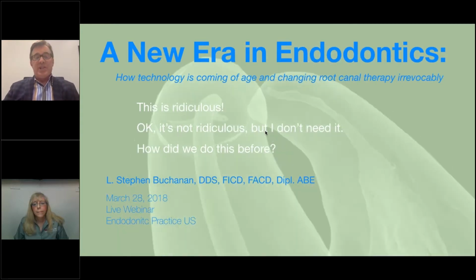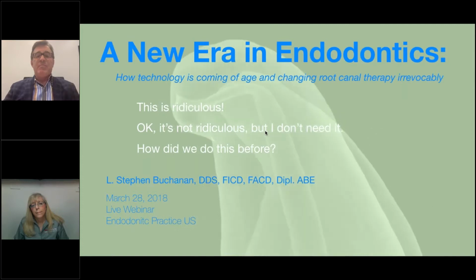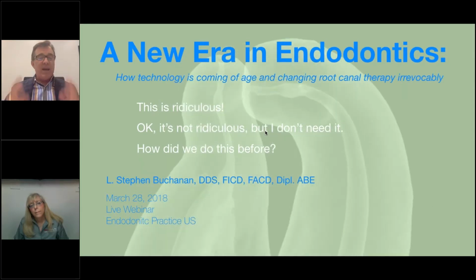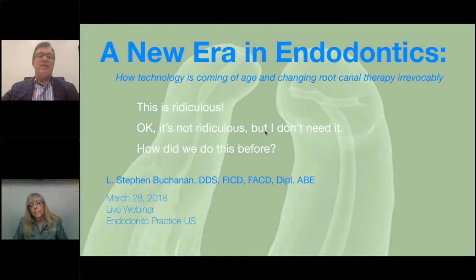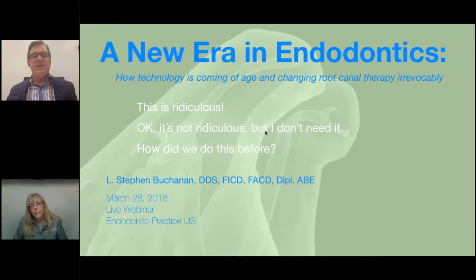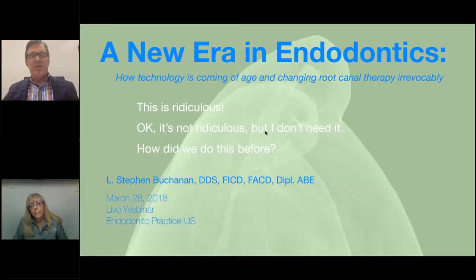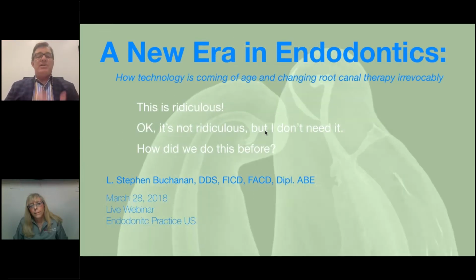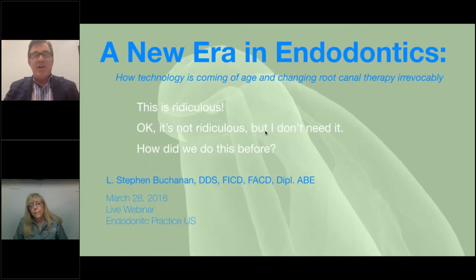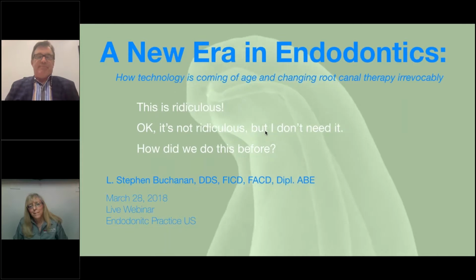Only 1% of the GPs have microscopes, and I think heads-up magnification is going to change that for them, because you can literally put the magnification camera over their body and aim it back up. You can put it on the side. You now have a 180 sphere of position you can potentially place it in, because your body's still in the same position. You're just looking straight at the monitor. It doesn't matter if they're standing on their head. You can see it.